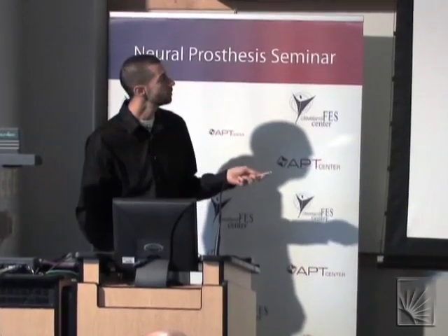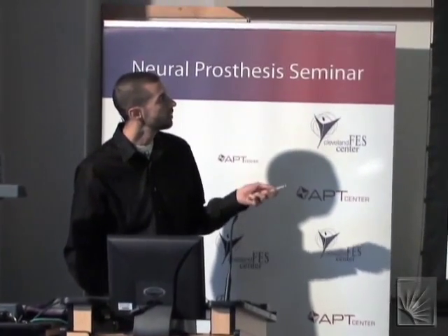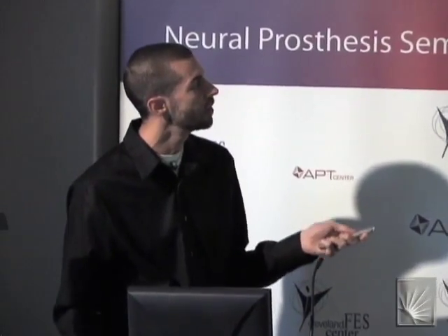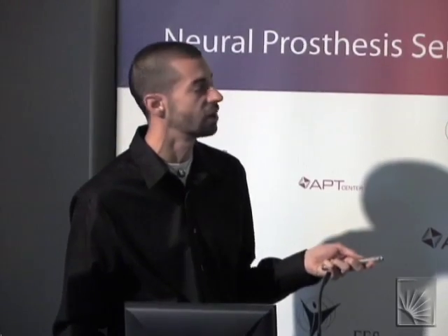So if you can use this brain atlas, if you can constrain it based on the MRI and based on the microelectrode recording data, then you can use the brain atlas to tell you about the rest of the three-dimensional geometry of this target area.